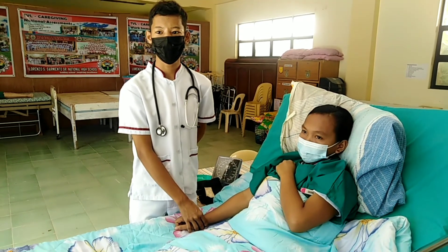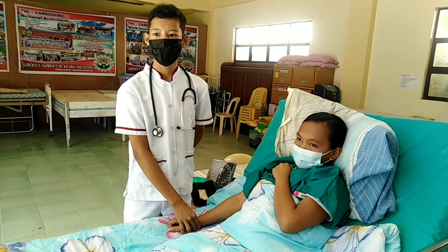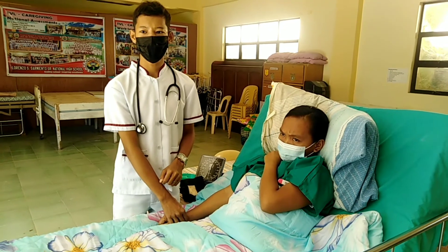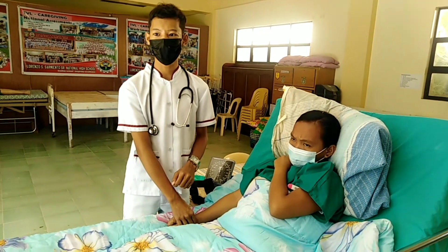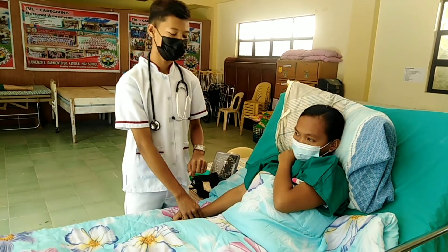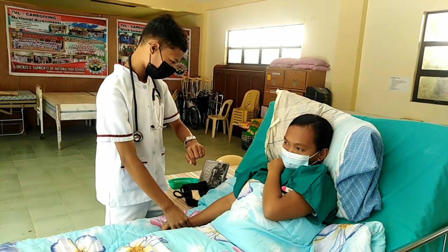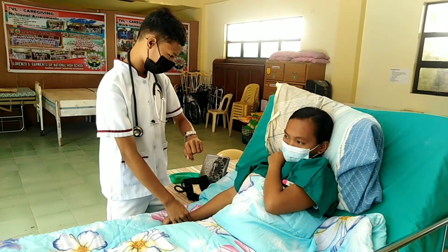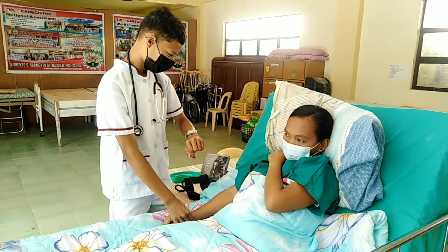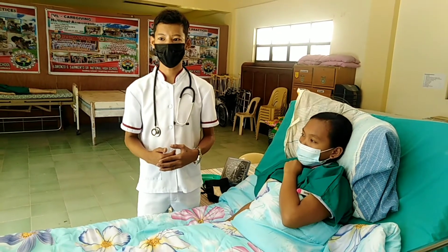Examine the rhythm and the strength of the pulse. After counting the pulse, prepare to count the respirations by keeping your fingertips on the client's pulse. Observe the rise and fall of the client's chest — one inspiration and one expiration. Count respirations for one full minute. Examine the depth, noting facial expression, cyanosis, and movement.